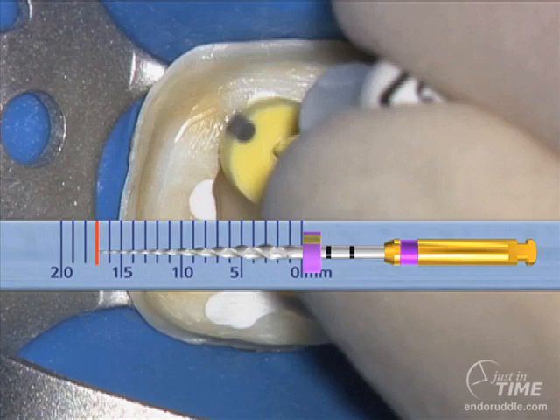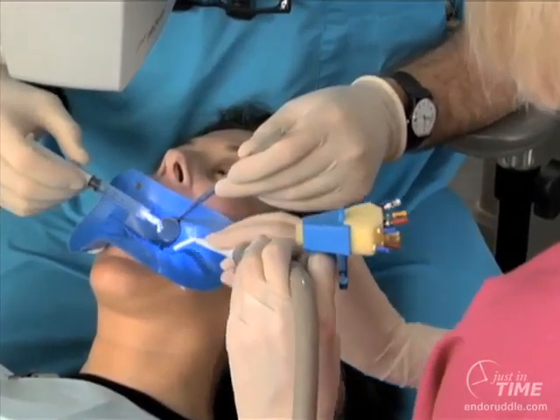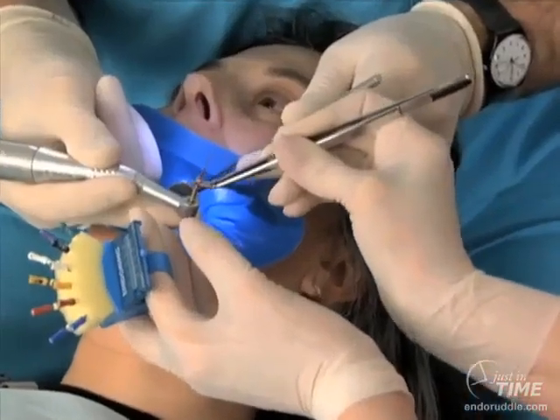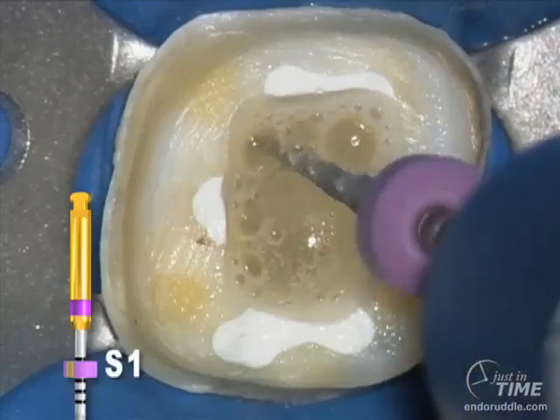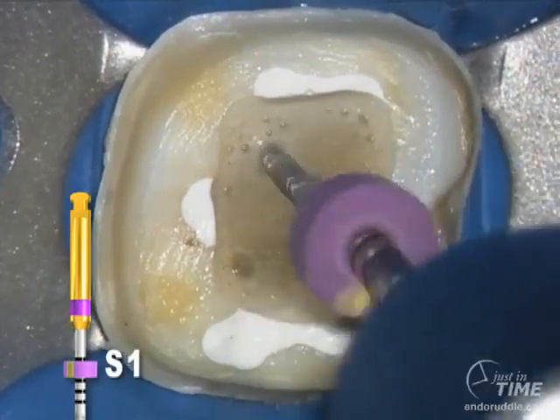It is now time to irrigate with sodium hypochlorite. I use a 6% solution. When we mix sodium hypochlorite with a viscous chelator, we get effervescence and a lot of bubbling. This tends to churn and deliver debris coronally. We float into the canal and we immediately begin to brush. We brush away from furcal danger. By brushing, we make lateral space.